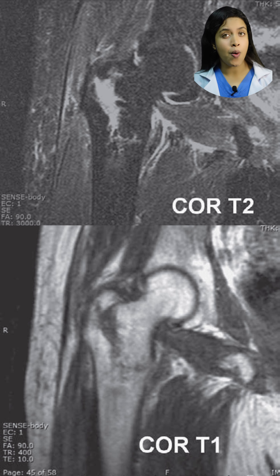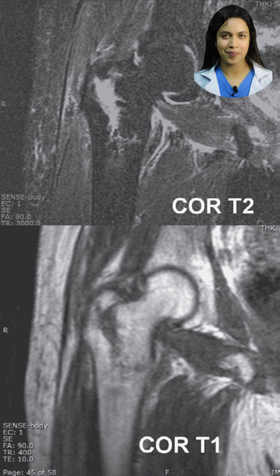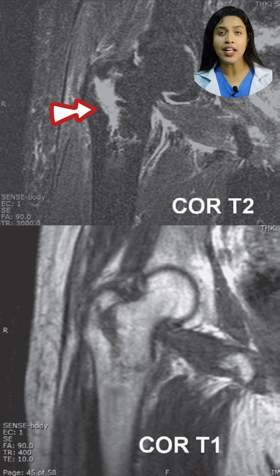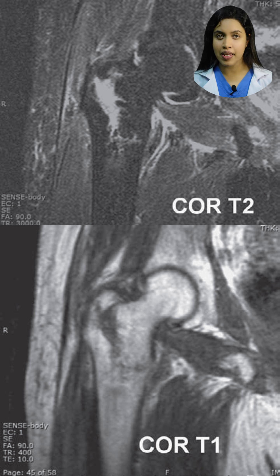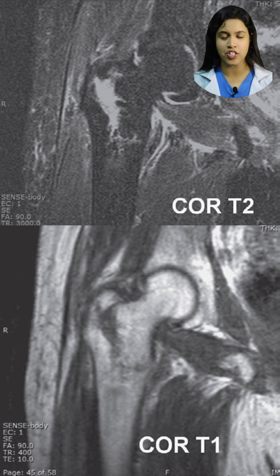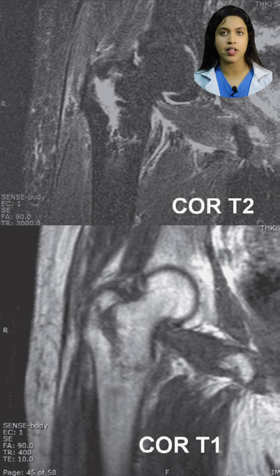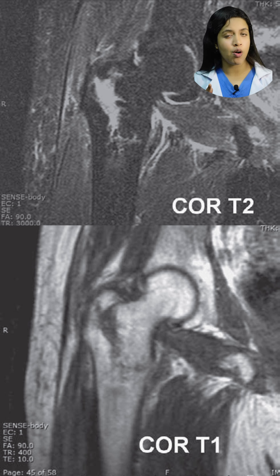We proceeded with coronal MRI scans, both T1 and T2-weighted sequences. Look closely at these images. On the MRI, we see an irregular focus of abnormally low signal intensity on the T1-weighted image and abnormally high signal intensity on the T2-weighted image, indicating a possible fracture. The MRI findings reveal an incomplete fracture extending across the intertrochanteric region, which is more evident on the T2-weighted image. This highlights the importance of MRI in detecting fractures that are not visible on plain radiographs, especially in osteopenic patients.